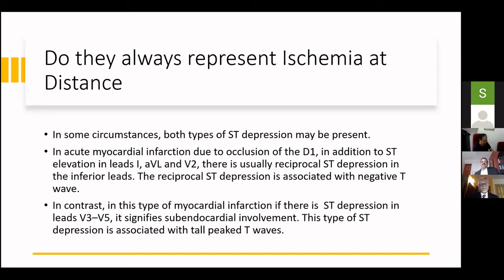Similarly, after having spoken to this, the last point I would like to touch upon would be about ECG as a localizing tool. We are all taught there's an ECG, there are 12 leads. You look at certain combinations of leads and you call them an inferior wall MI, inferolateral MI, inferoposterior MI, anterior wall MI, anteroseptal MI, extensive anterior wall MI, certain things which we do as our own descriptive diagnosis.